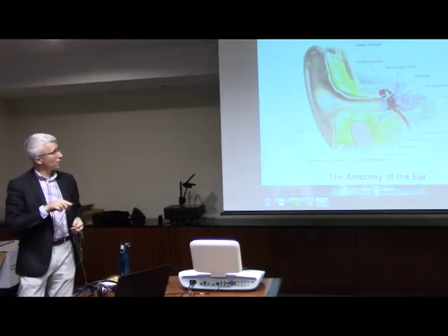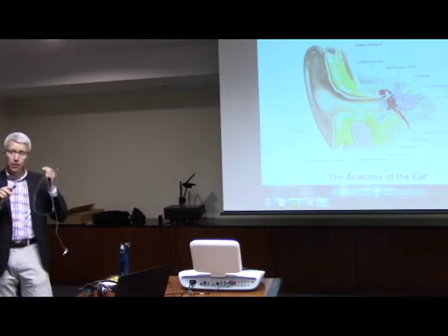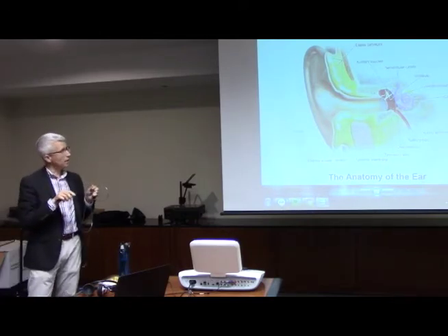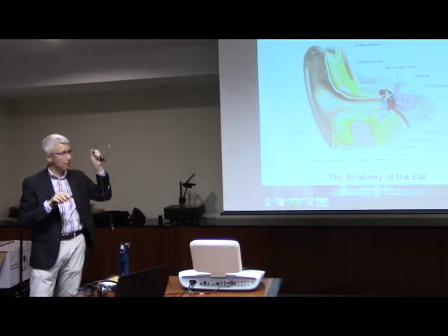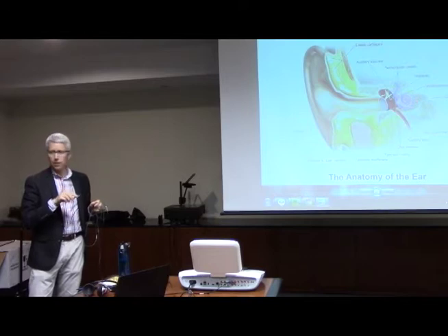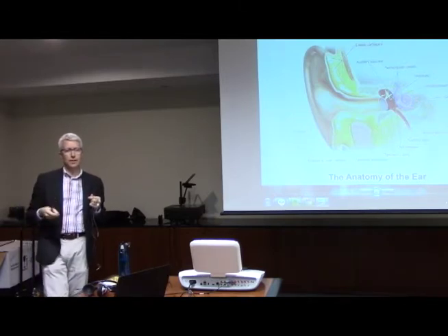So if I have a hearing loss when I put the headphones on, and then I put this on and I don't have a hearing loss, that tells me this is working fine, but this isn't. Or if I have a hearing loss when the headphones are on and when I have this on, it says that the problem is in here, because they agree. So we can use this to determine what type of hearing loss it is.